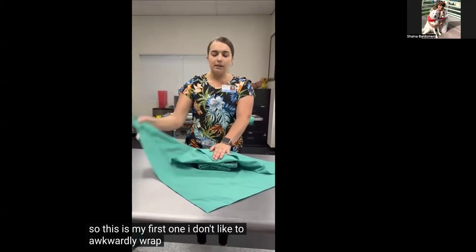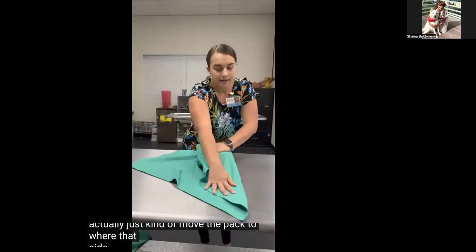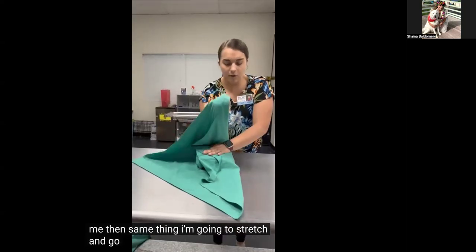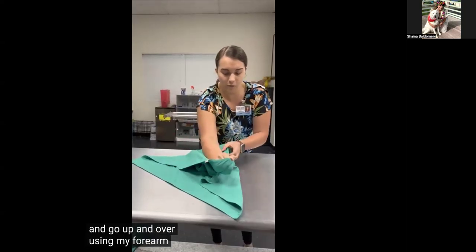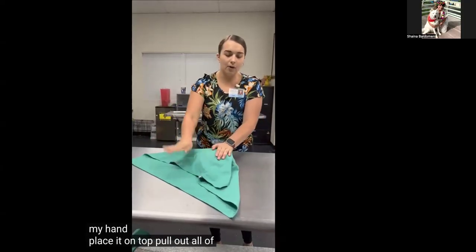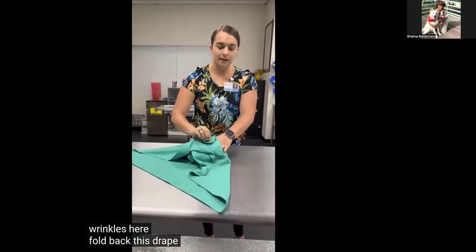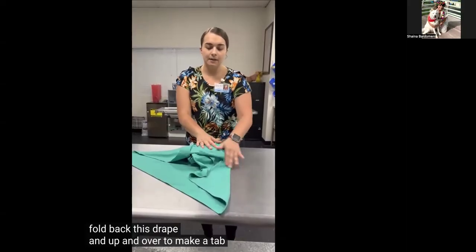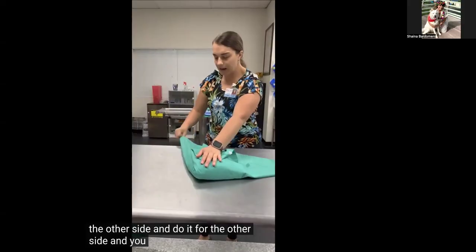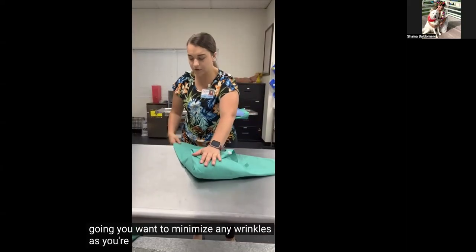I don't like to awkwardly wrap from the side, so I'll just move the pack to where that side that I'm folding is faced towards me. Then same thing. I'm going to stretch and go up and over. Using my forearm to go down, I can remove my hand, place it on top, pull out all of these wrinkles here, fold back this drape, and up and over to make a tab. Then same thing, I'm going to move it to the other side and do it for the other side. And you can adjust it as you're going. You want to minimize any wrinkles as you're folding these gowns.